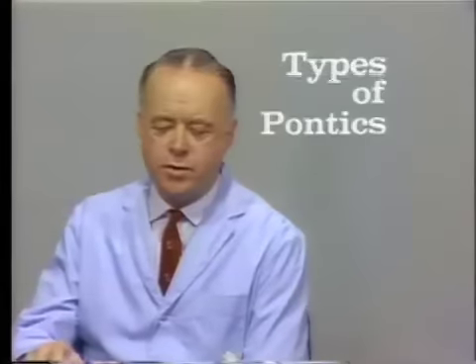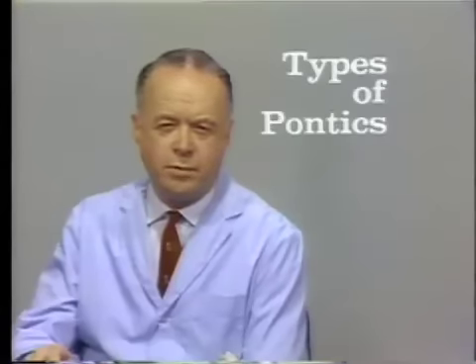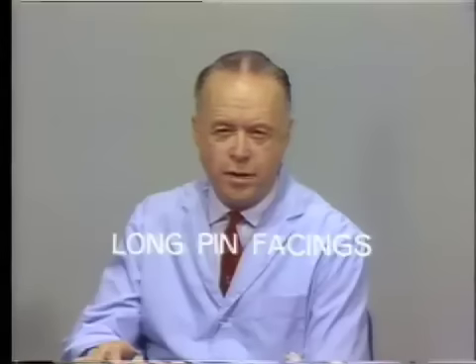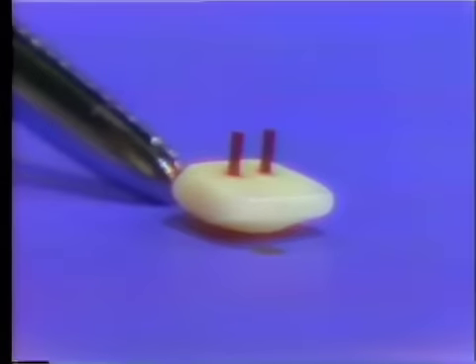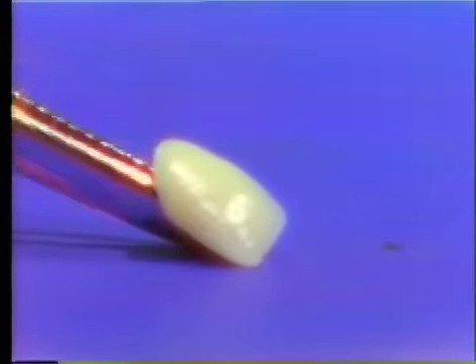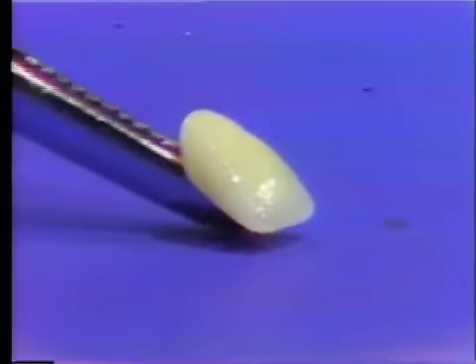Now that we've discussed the principles underlying the design of posterior and anterior Pontics, let's take a look at some of the various types of Pontics which are utilized to meet these requirements. Long pin facings have been used for a considerable number of years and serve very satisfactorily as Pontic facings for all teeth in both the maxilla and mandible. Here are some long pin facings. This is a long pin facing for a central incisor tooth. You see the two projecting pins, and on the other side the labial surface already contoured and shaded and characterized for that particular tooth.